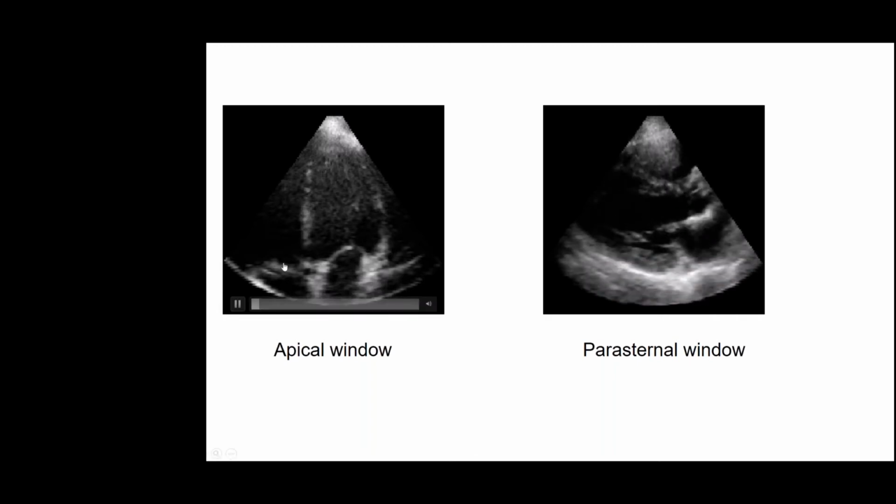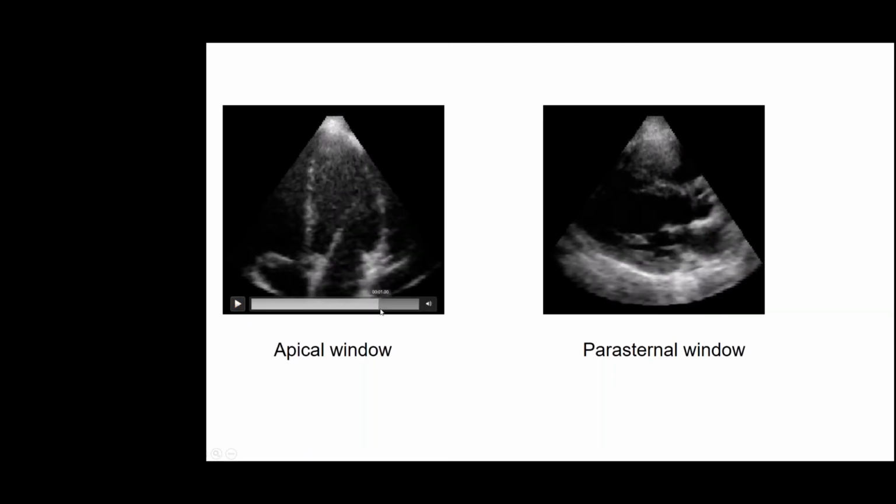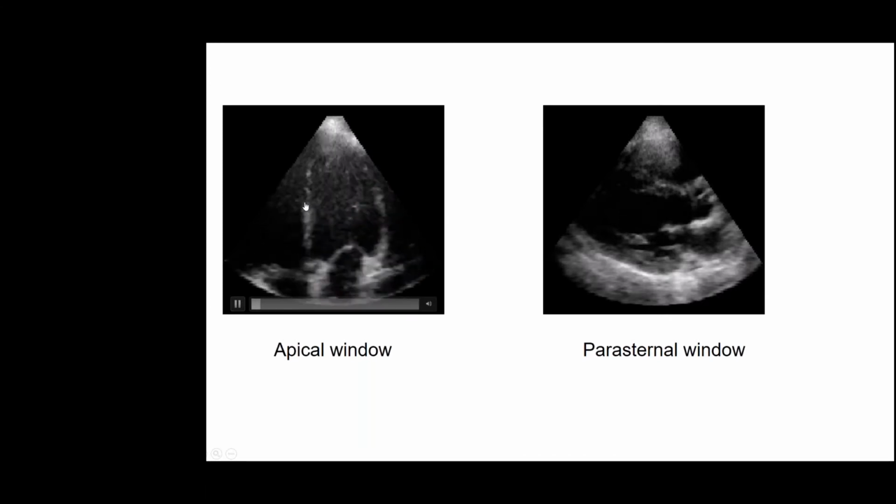And one of the interesting things about this is the presence of speckles. So speckles are these, if I can turn this on again, I think this one doesn't want to move. Okay, so you see the little dots that appear that form this textured image. They are called speckles, and they are supposed to move together with the tissue. So if we can identify one of these speckles and follow it as the heart beats, then we can estimate the deformation of the heart also in real time. And there are systems that use this speckle tracking to estimate the deformation.